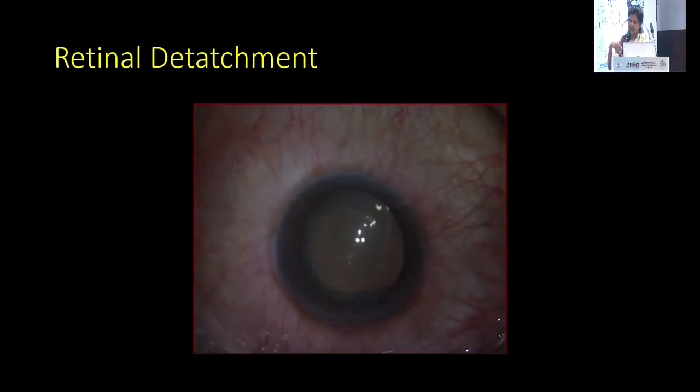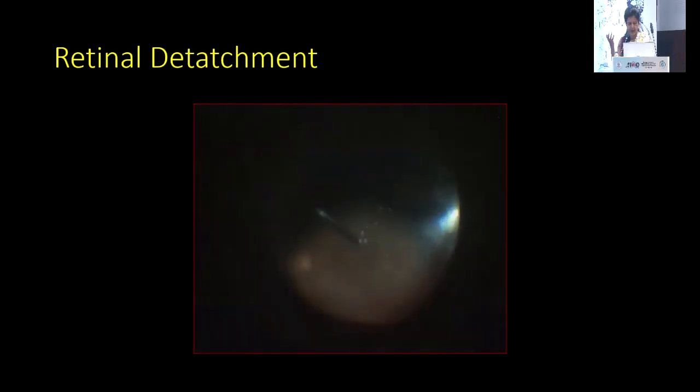So I've done other cataracts also. Even after removing the ICL, femtosecond can also be done via the ICL.